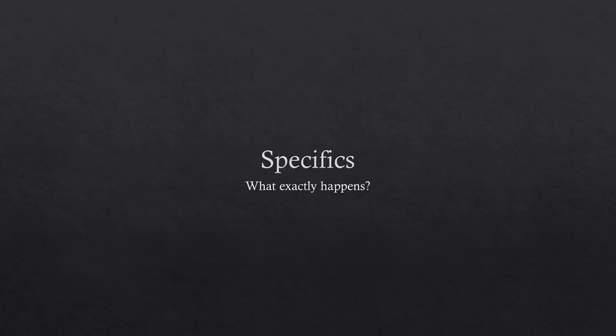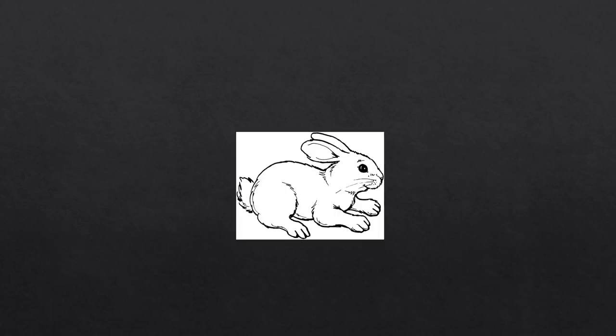Okay, so now that we have a general idea of what's going on in IHC, let's get to the specifics. The first part of IHC is getting the correct antibodies. Antibodies come in two forms, monoclonal and polyclonal. Let us take our discussion to polyclonal antibodies first, because they are similar to the antibodies we have in classical immunology. The first thing to realize is that we cannot actually use human antibodies for immunohistochemistry.